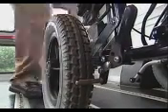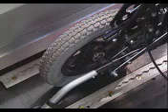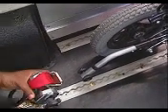Apply the wheel locks, or if motorized, turn off the power. Once you have the wheelchair centered and locked between the tracks, you are ready to attach the rear strap.